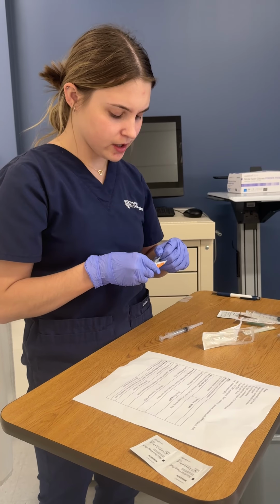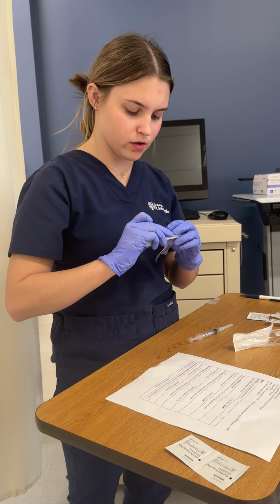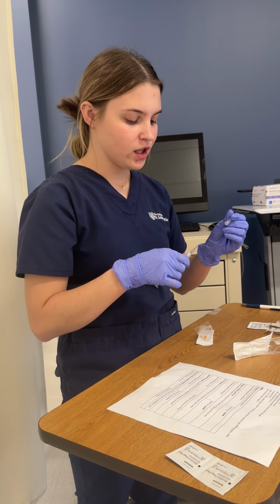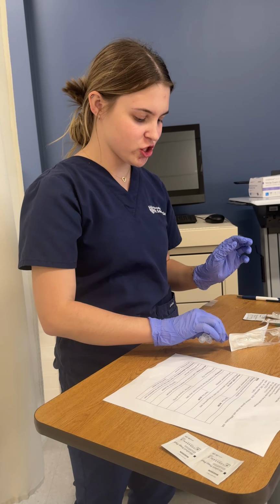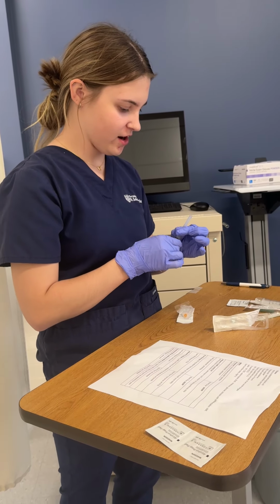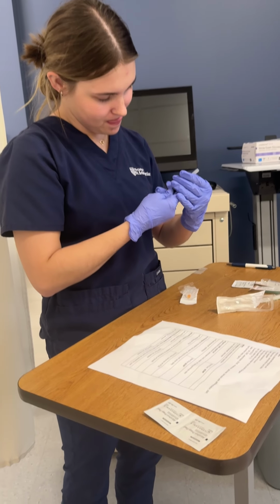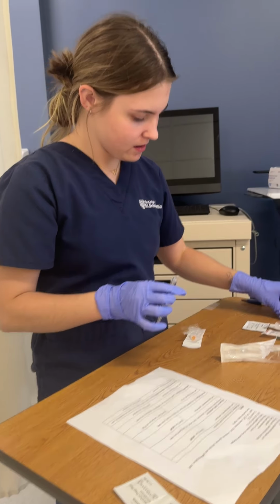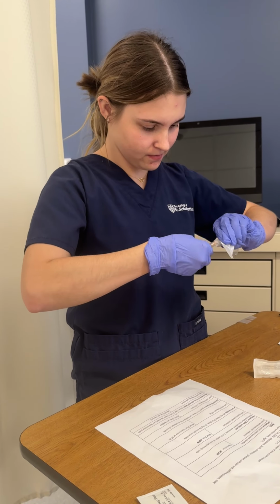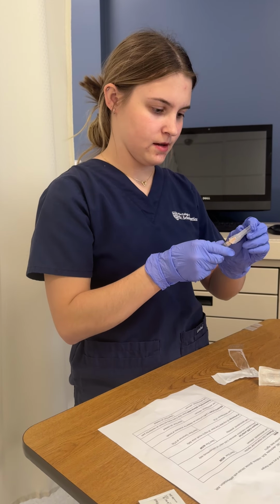If the client was obese, we would think about using a 1 1/2 inch needle. So I'm just gonna recap that again like that because I accidentally took it off. Okay, and now we're gonna put this on. Okay.